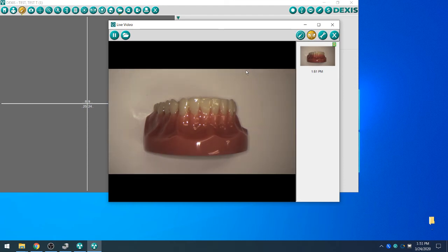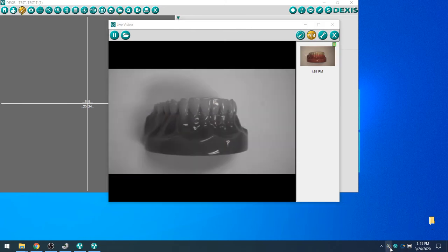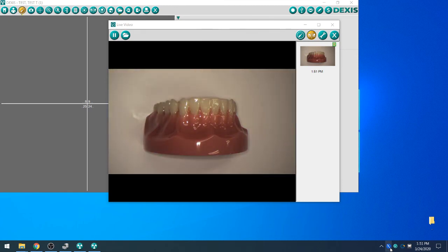From here, we'll test to make sure that the Lume is working as it's supposed to by double-clicking on it. It should go to grayscale, and double-clicking on it again will go back to color.